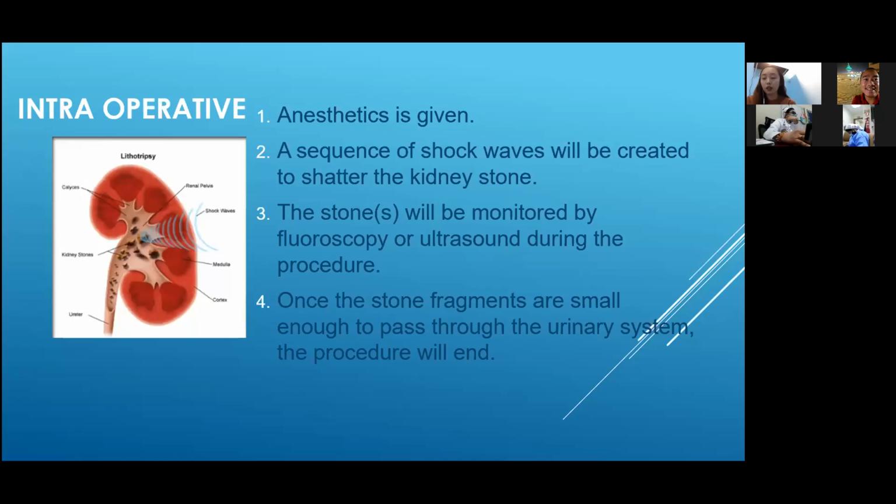of the surgical procedure and until the client is being wheeled into the recovery room. So these are the sequences in the operative procedure of the ESWL. Once the anesthetic is given, it is our sole responsibility.